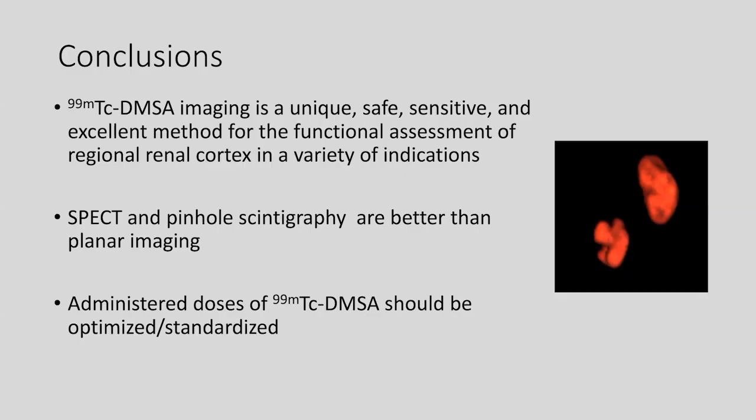So in the future, not only because of improved imaging technology, but also by reconstruction technology, the instrumentation and software, perhaps the imaging will be optimized and the dose may be reduced significantly, even though we already are reducing the dose. So in summary, excellent method, very unique.